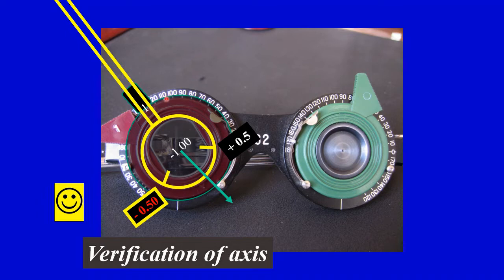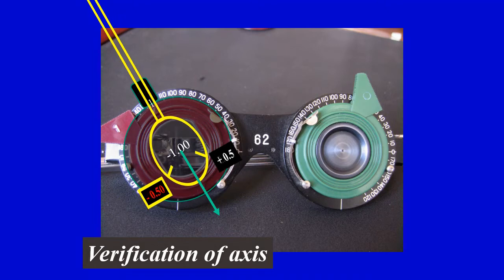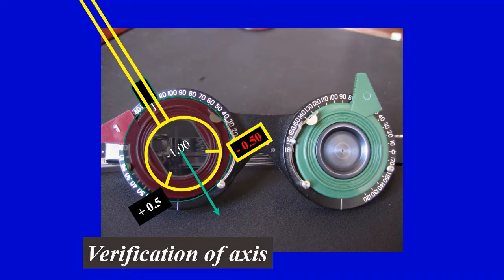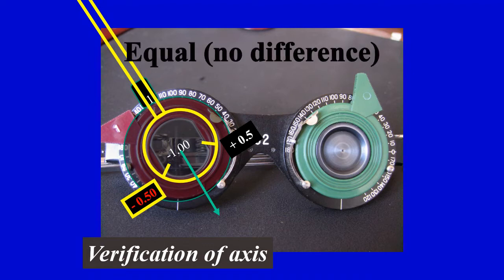The first time we rotate by 10 degrees, but now we are going back, so we'll rotate by 5 degrees, and then we're going to repeat this several times until we reach the end point, when the patient tells us that he sees equally in both positions. There is no difference between the first or second position. Now we're going to check the power of the cylinder.